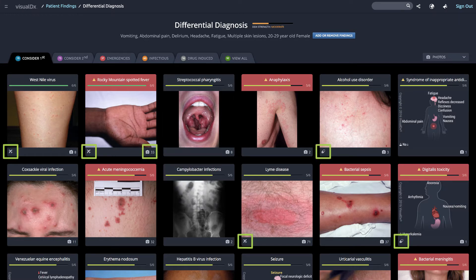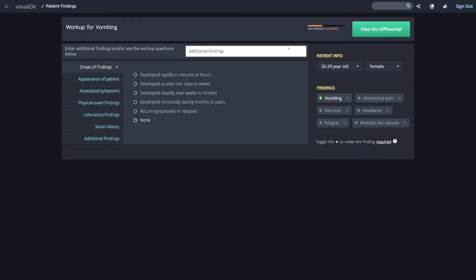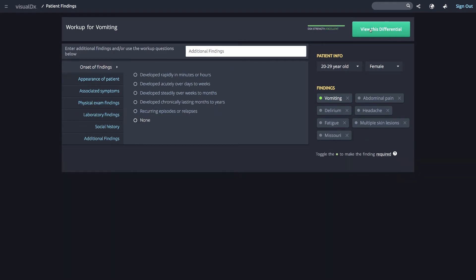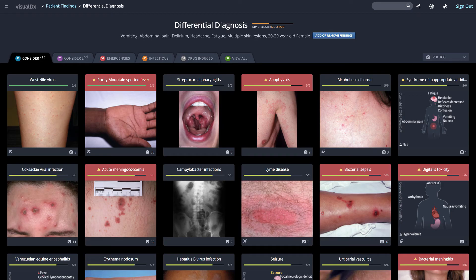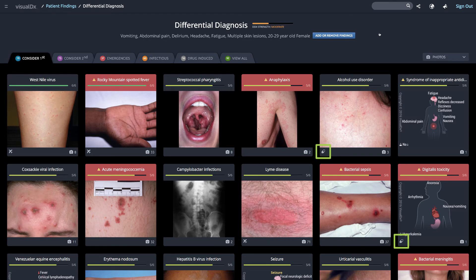Underneath the image or symptom-con are icons that quickly show you more information about the diagnosis. A plane indicates a diagnosis that can be travel-related, so Rocky Mountain spotted fever has a plane. But there's a catch: if you add a travel finding when creating your differential, the plane icon won't show up because VisualDX already knows you're considering travel. If you don't put in a travel finding but the diagnosis could be travel-related, the plane will show up. A pill indicates a diagnosis that may be caused by a medication reaction.